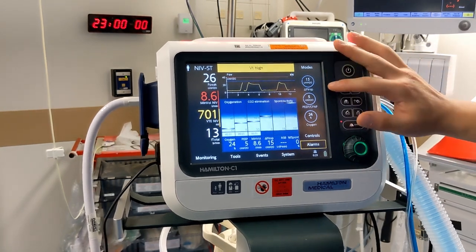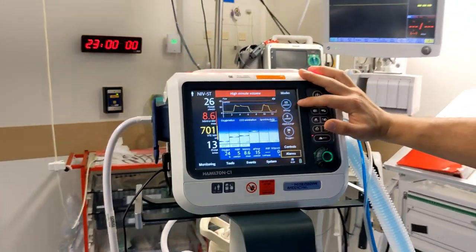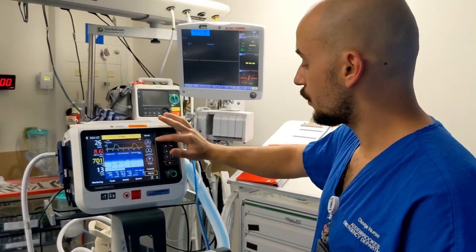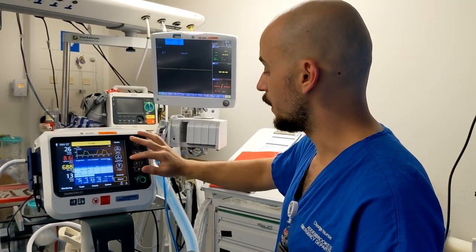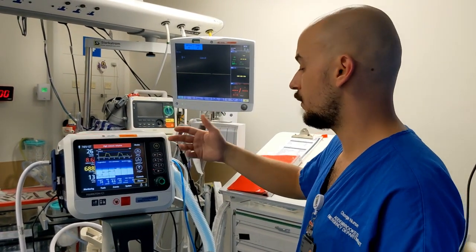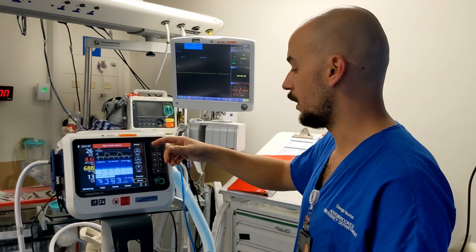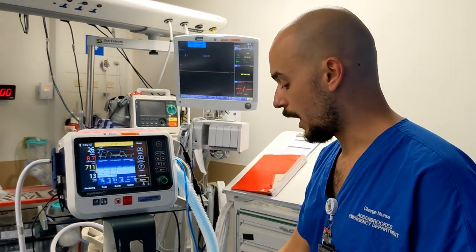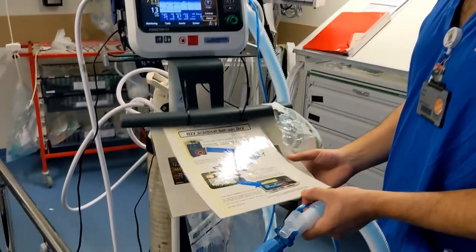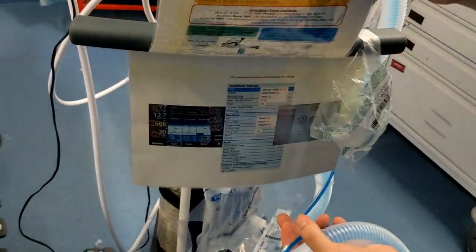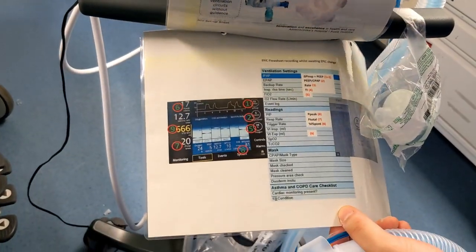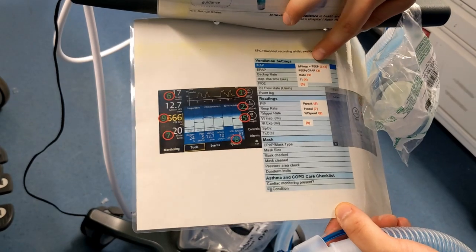The take-home message: IPAP is the sum of the two pressure numbers shown, and EPAP is the lower value. If you forget the calculation, you can refer to the instructions on the machine — how to set it up is listed there, as well as how to calculate IPAP and BiPAP pressures.